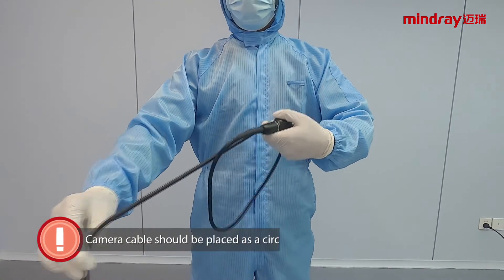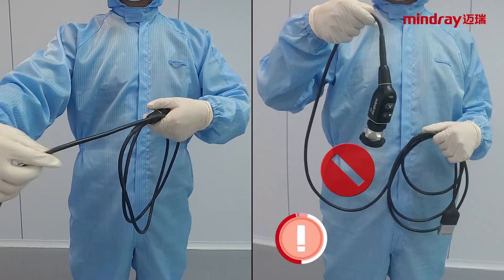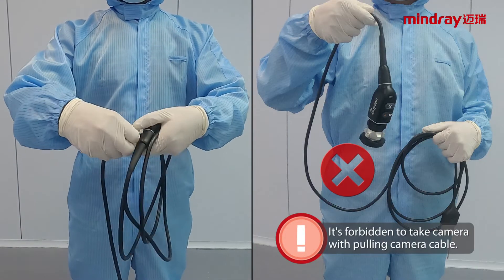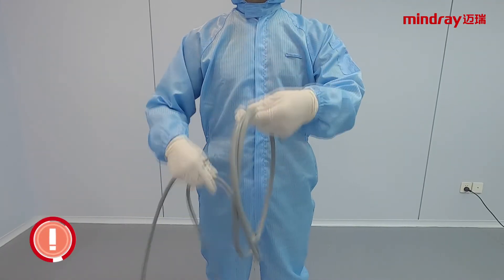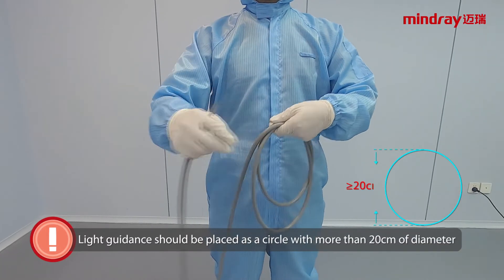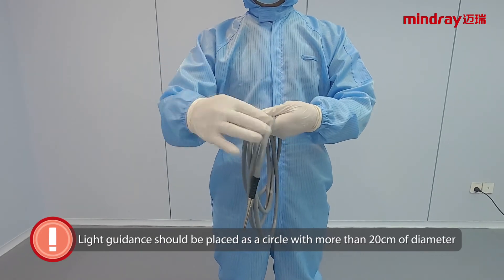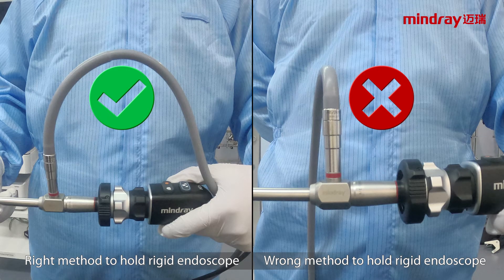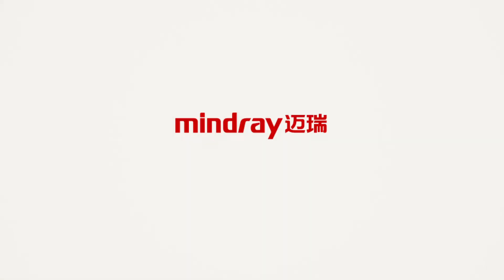Attention: the camera cable should be placed in a circle with a diameter of more than 15 cm. It is forbidden to carry the camera by pulling the camera cable. Similarly, the light guidance should be placed in a circle with a diameter of more than 15 cm. Use the correct method to hold the rigid endoscope and the plug-in system.